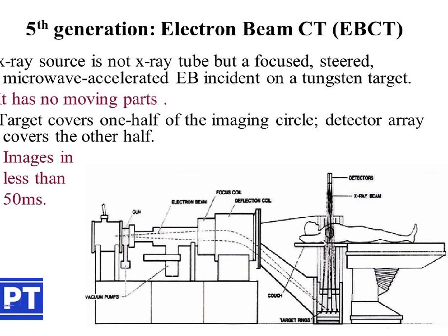It has no moving parts. Everything is stationary. The target covers one half of the imaging circle and the detector array covers the other half. The scan time is less than 50 milliseconds.